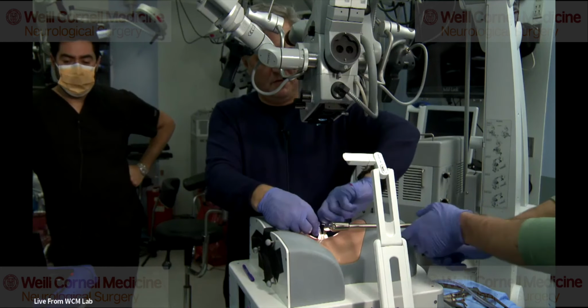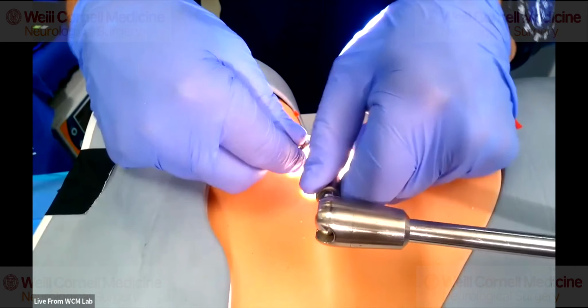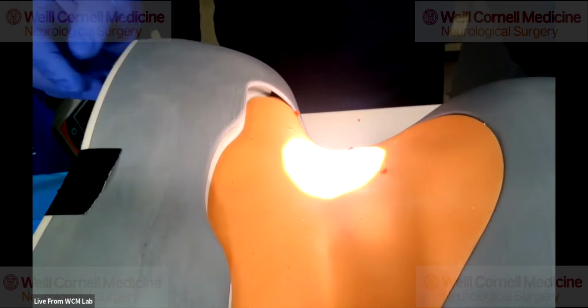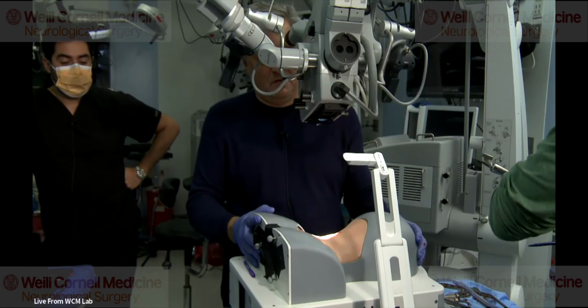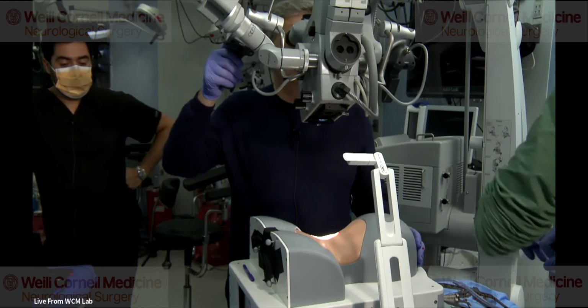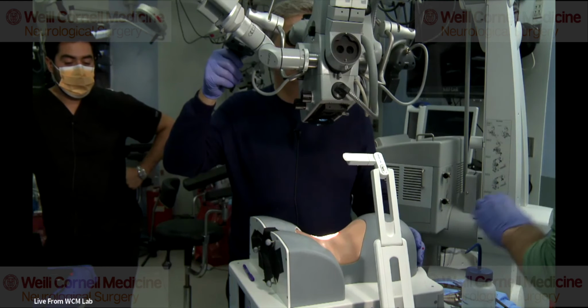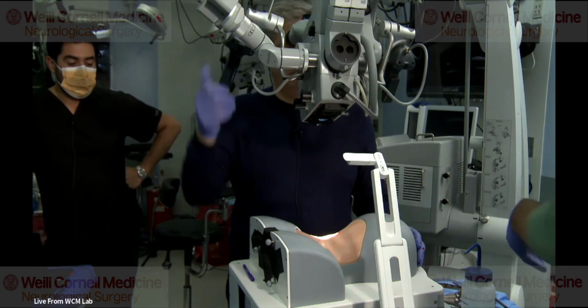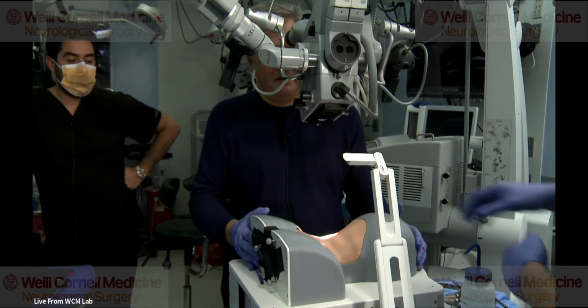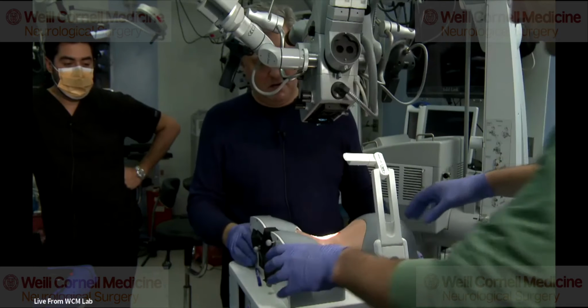I think, just like you mentioned, we do another scan, and I think everyone might be concerned that this is affecting our workflow too much. But can you guide us, how much time does it take you to do another scan and move on into your surgery? Because I've seen it, but I think people would like to hear from you.